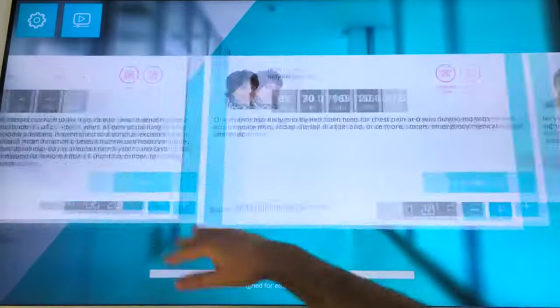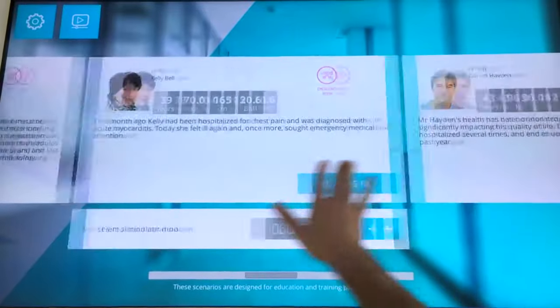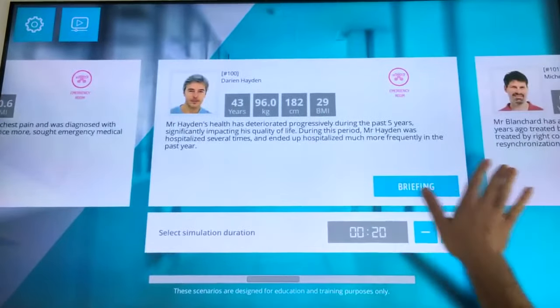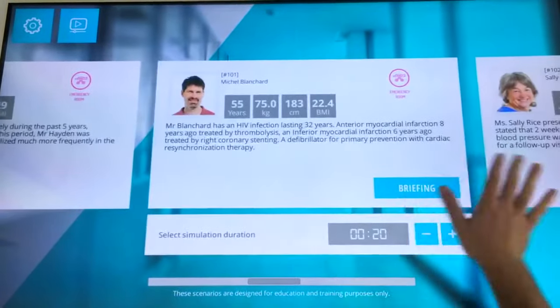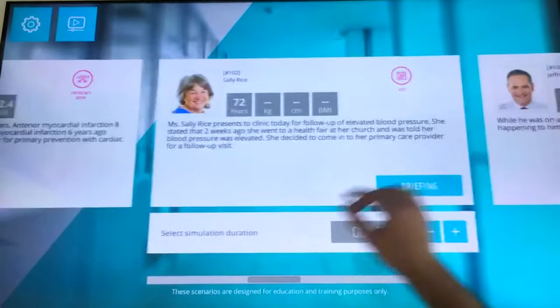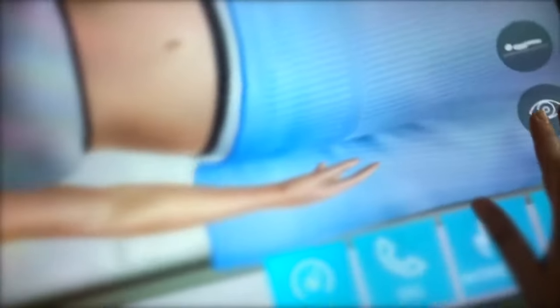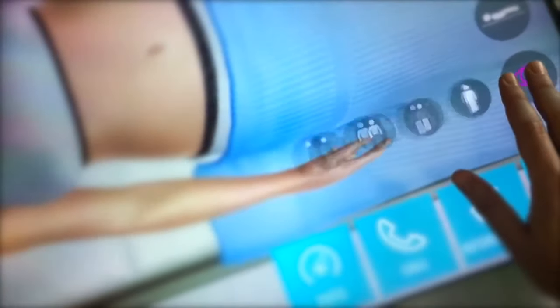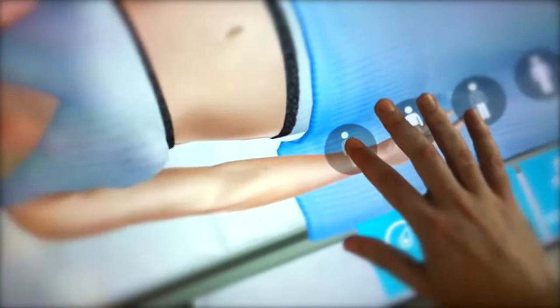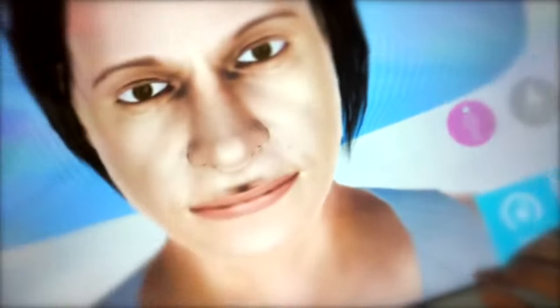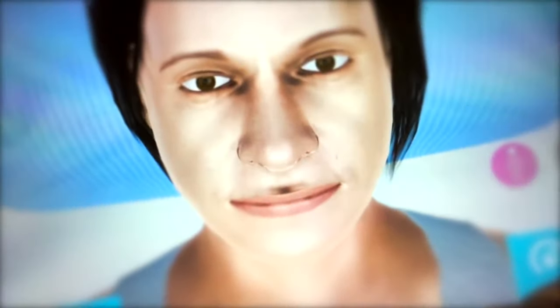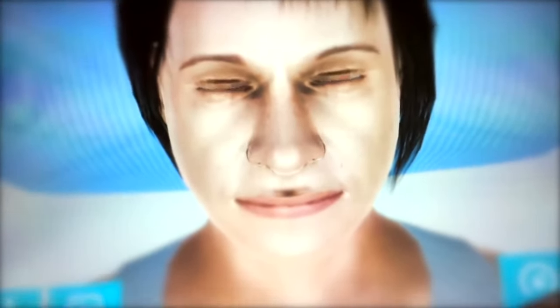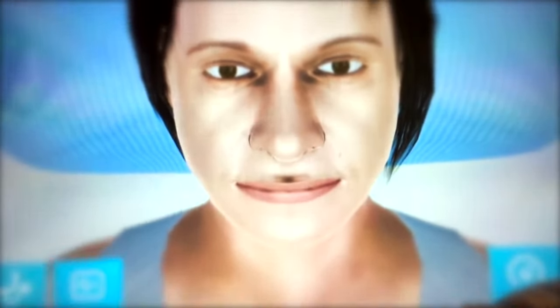These tools are connected to Body Interact, the clinical education simulator, based on 3D virtual patients and advanced physiological algorithms that react to any actions or procedures.